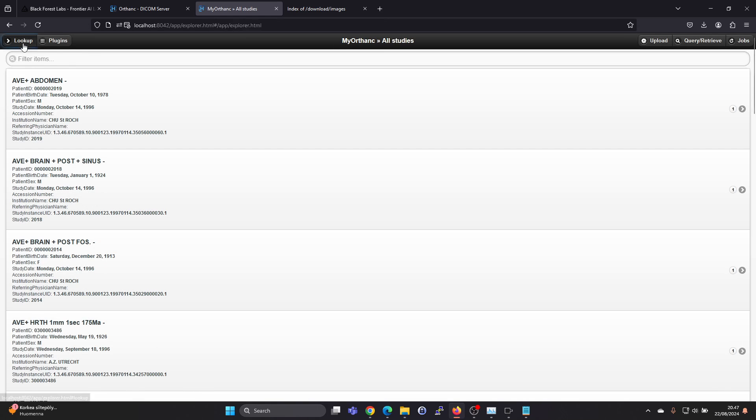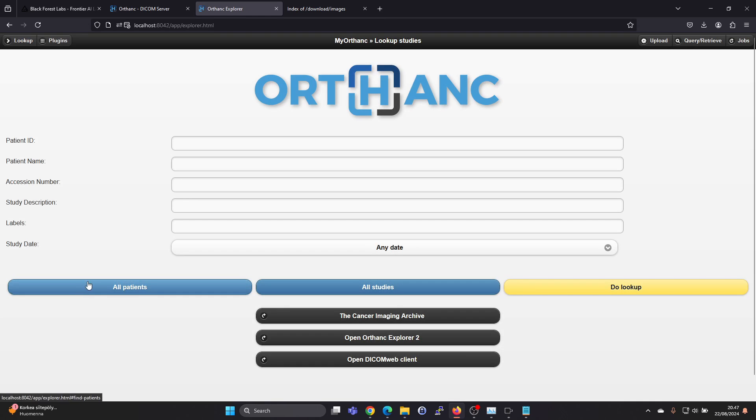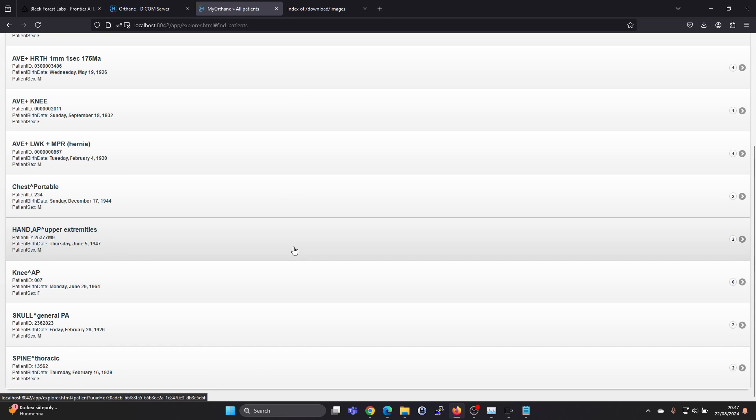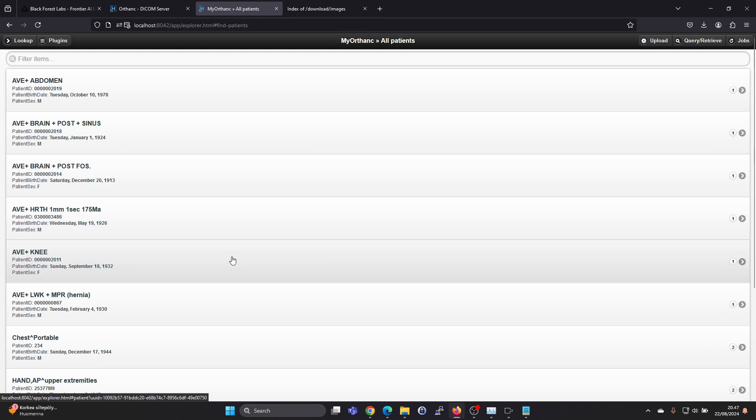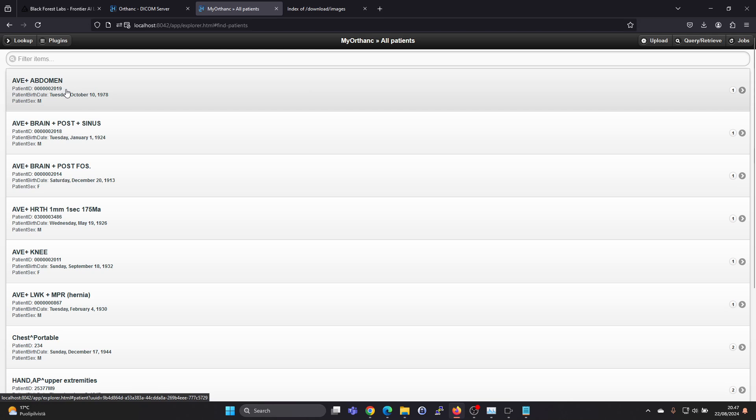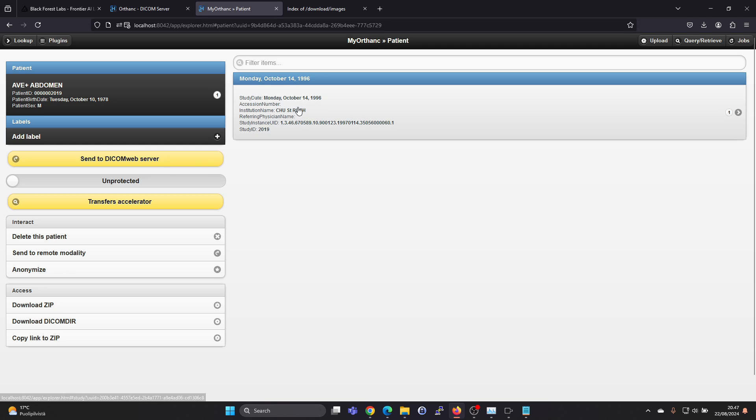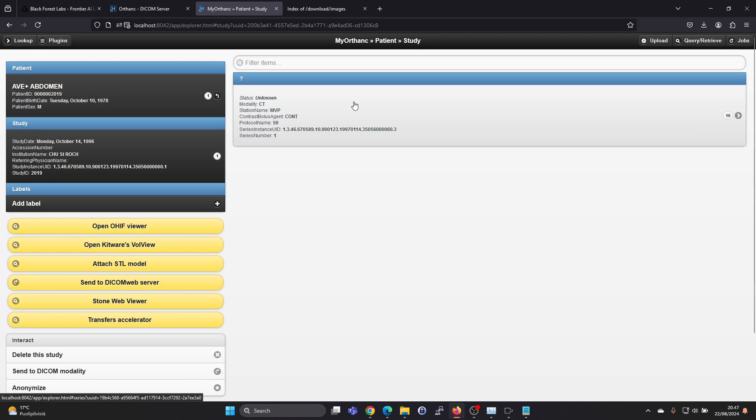And we can select all studies, or we can select all patients, and we will see a list of patients and studies here. And we can select this first one.